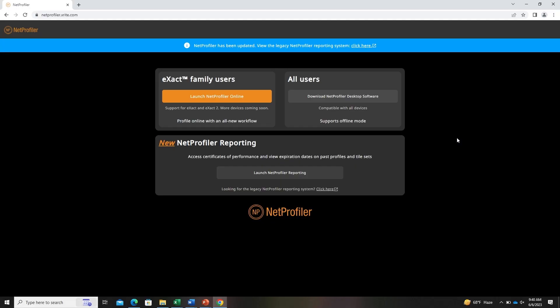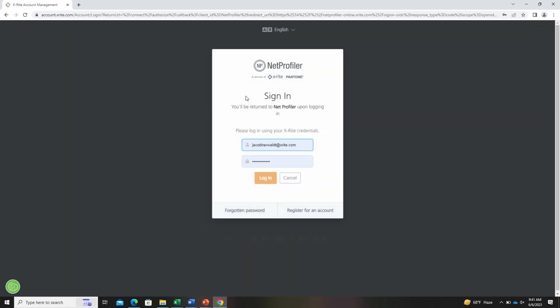Hi, I'm Jake and I will be showing you NetProfiler with the eXact 2. Once on this screen we will launch NetProfiler online where you will log in with your My X-Rite credentials. If you do not have one, you can register for one here.